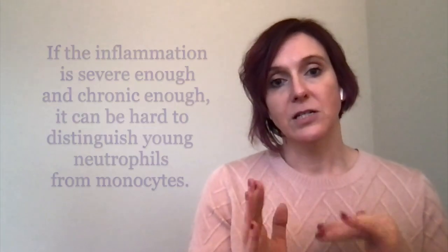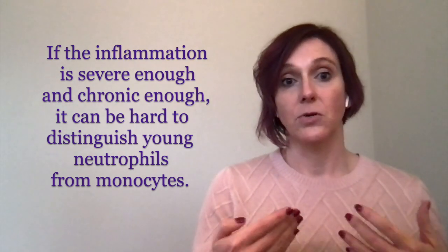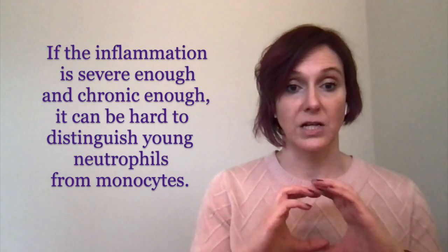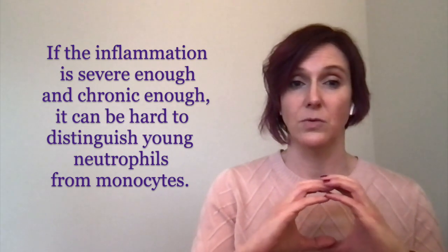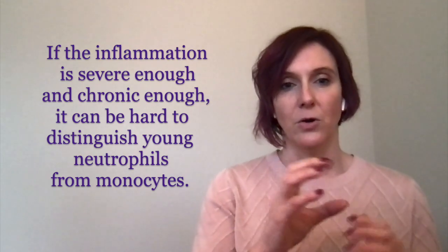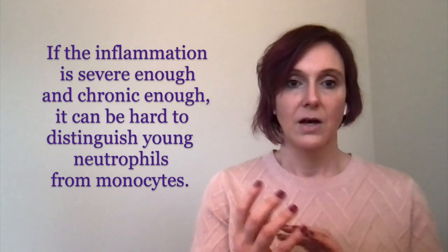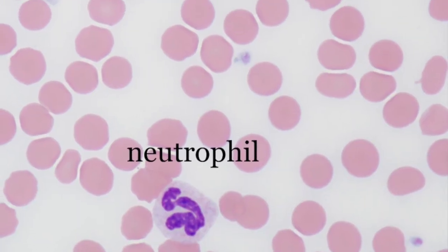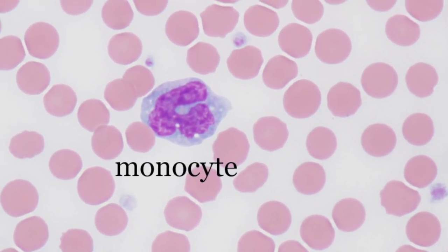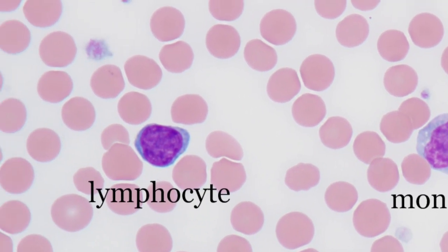The thing with toxic neutrophils is that if the inflammation is severe enough and it's been going on long enough, it can be really hard to distinguish the neutrophils, especially ones that are like bands that having that C shape to them, or even metamyelocytes. It can be really difficult to distinguish them from monocytes. And that's something that takes a lot of practice and looking at a gazillion blood films to hone that particular skill. Okay, so if it's really severe inflammation, you're looking at it, you're just not sure.